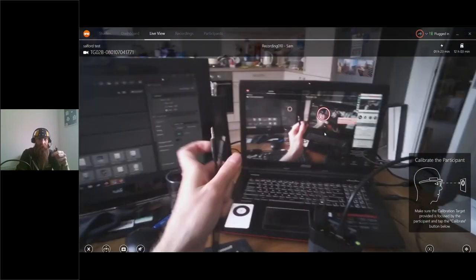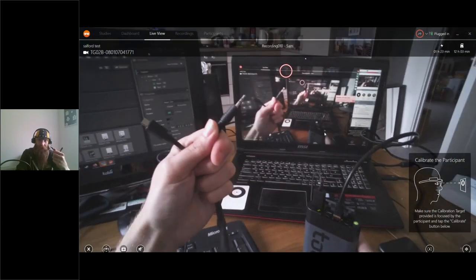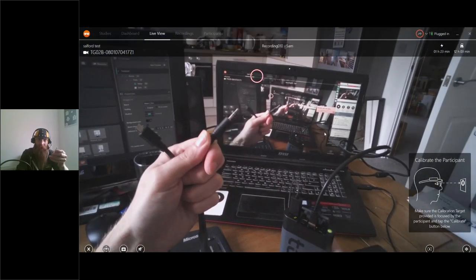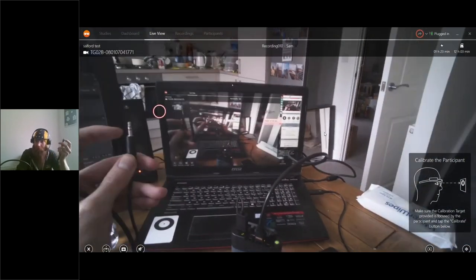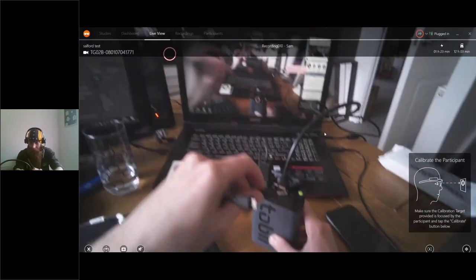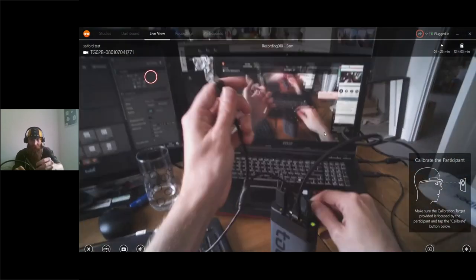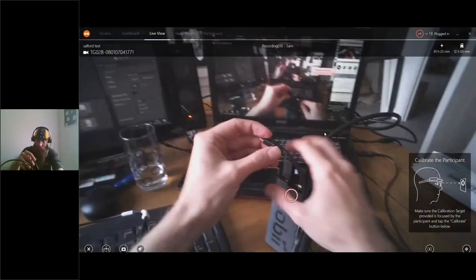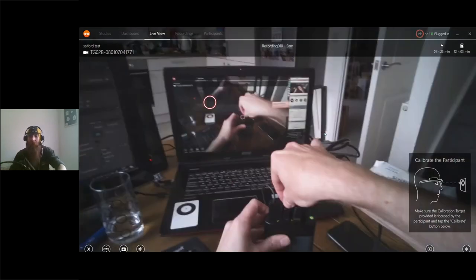The important one here really is the 3.5mm connector. This is what actually carries our TTL signals. If I remember correctly, the tip receives, the middle ring sends, and the bottom is the ground, but you can check that information in the manual. And if we plug this in here, the USB, if I understand correctly, and I'm sure my colleagues will correct me if I'm wrong, just helps to charge the battery from the EGO device.